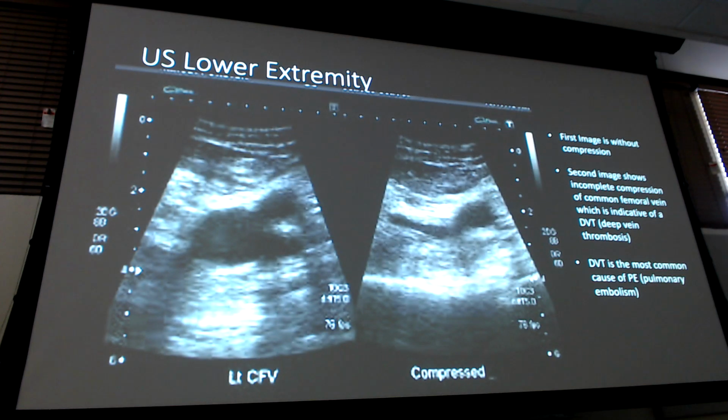Next, when they're doing the ultrasound, they keep it there and they put pressure on it. Because remember, fluid is black on ultrasound. But I can't tell you blood, like a clot, from blood that's liquid, because that's the same density as far as the ultrasound is concerned.